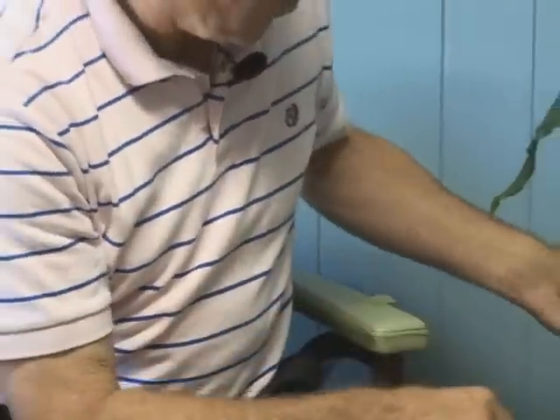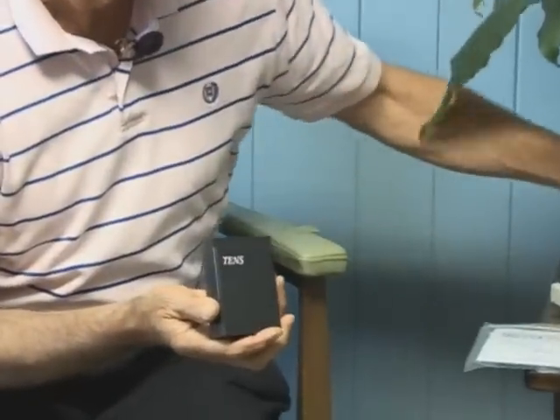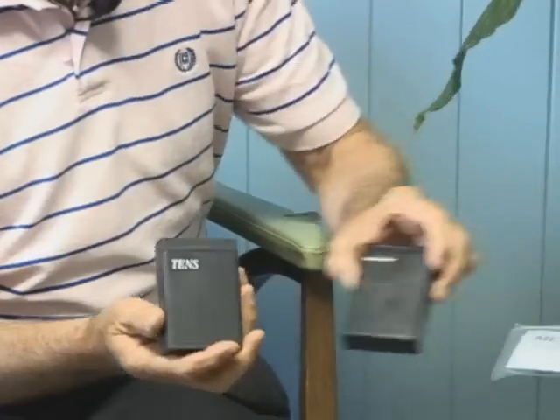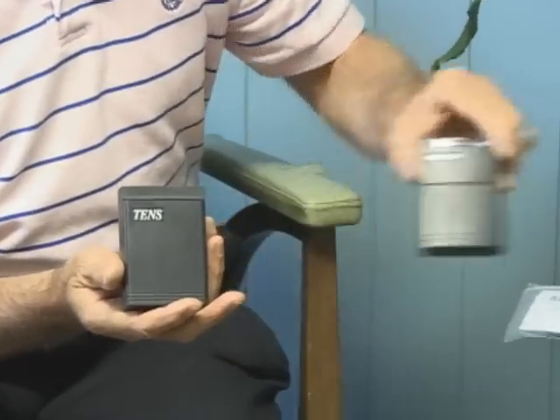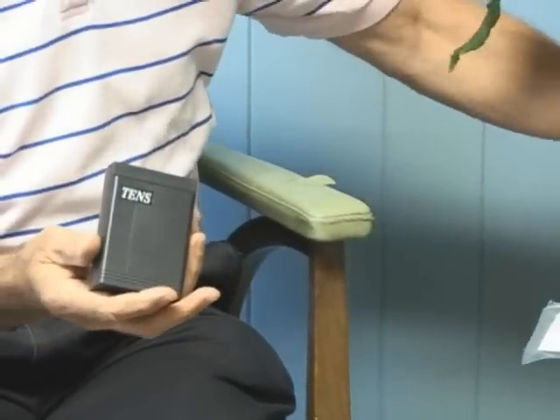What is used often is what is called an analog TENS unit. I'm just showing you a couple of analog TENS units. Here's another one, but they're basically all the same. With any analog unit, you have a cable.